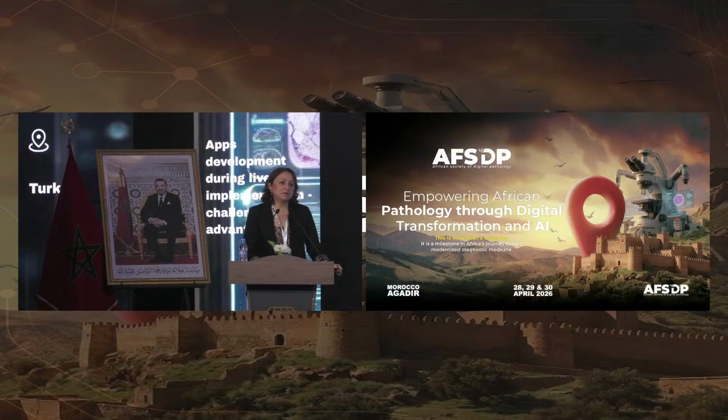Tracking, I think, should be the first step. It is also to make readiness for digital pathology, lab tracking for patient safety, accession included in tracking. And if you report from lists at the beginning, it can be something for a first step. These QA issues can be in the second or third step, but you should plan that and ask for it from the developer. Thank you very much.